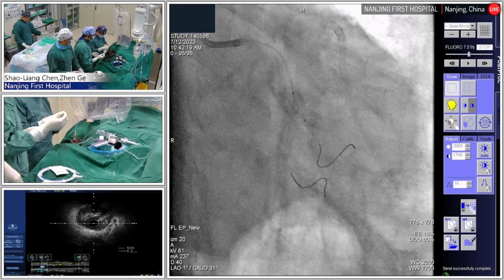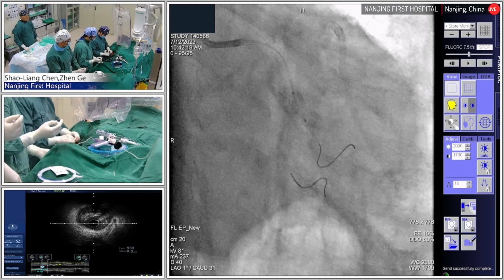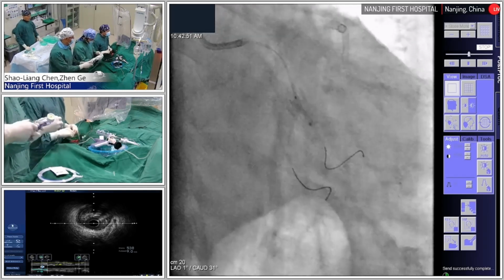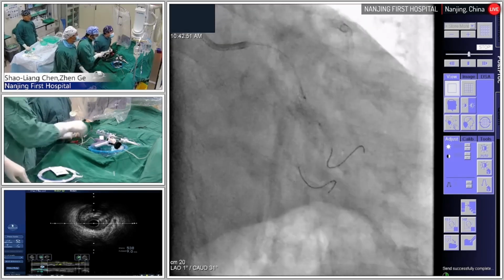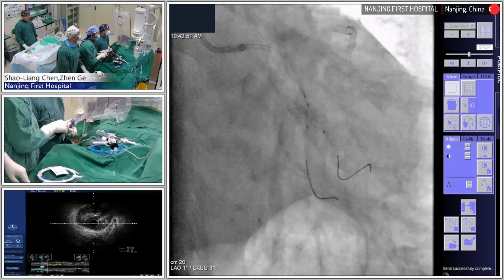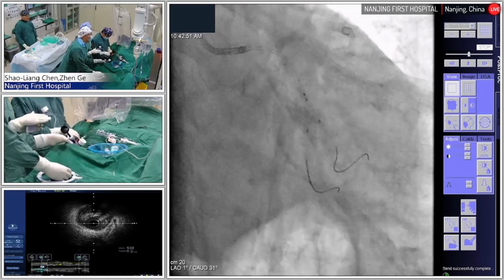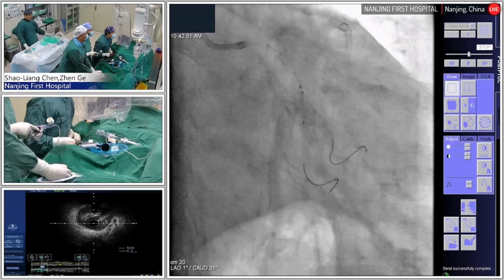A very good point to show how to do the kissing in the correct way. For some cases, for example patients included in our ongoing kissing quality trial, after balloon crush and stenting, just before rewiring that branch, we can use IVUS to assess the real position of rewiring.